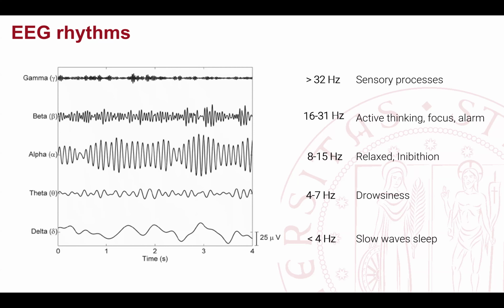And you immediately see that this peak is reduced. Why? Because okay, they relax their brain, but then you ask the brain to do something that requires attention, and so this produces a reduction.